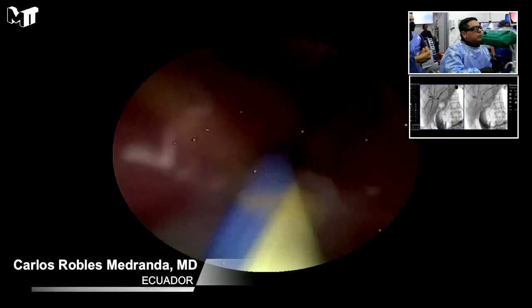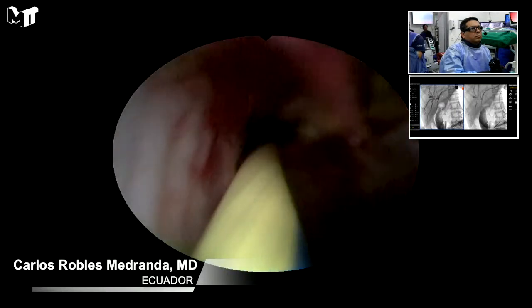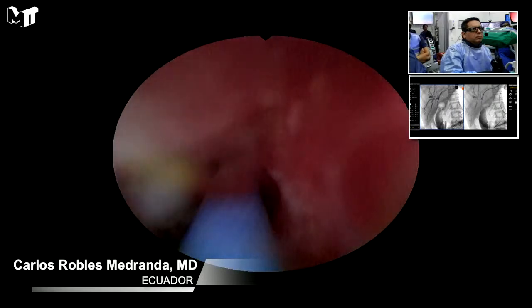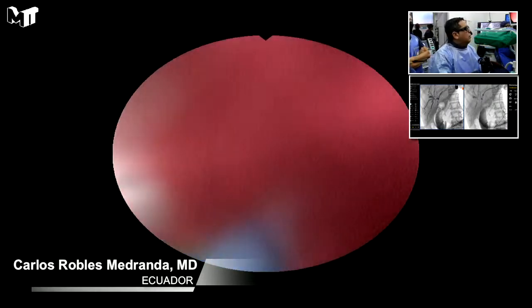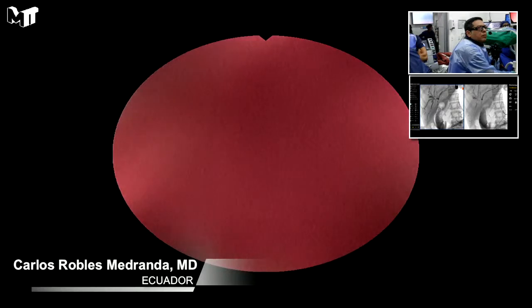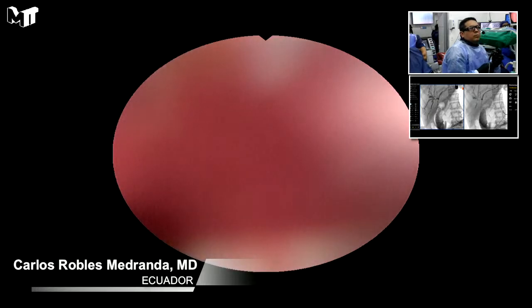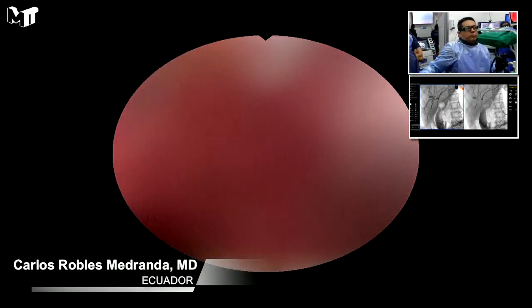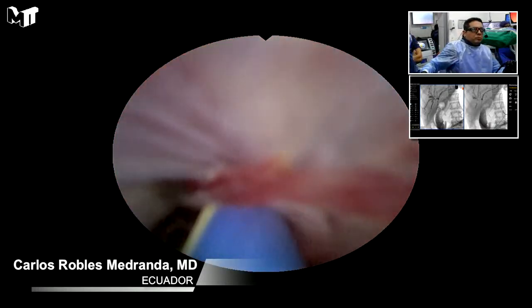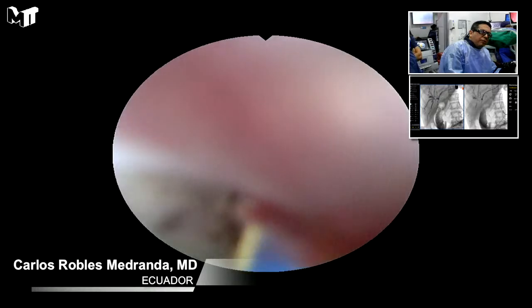Let's see. I have to be cautious. You see?